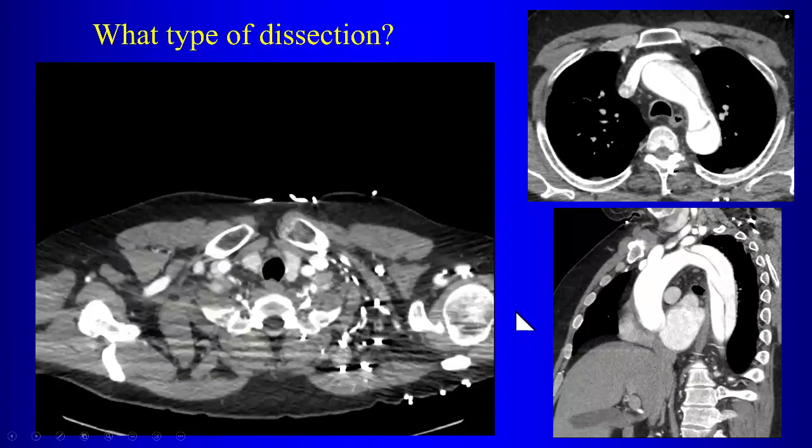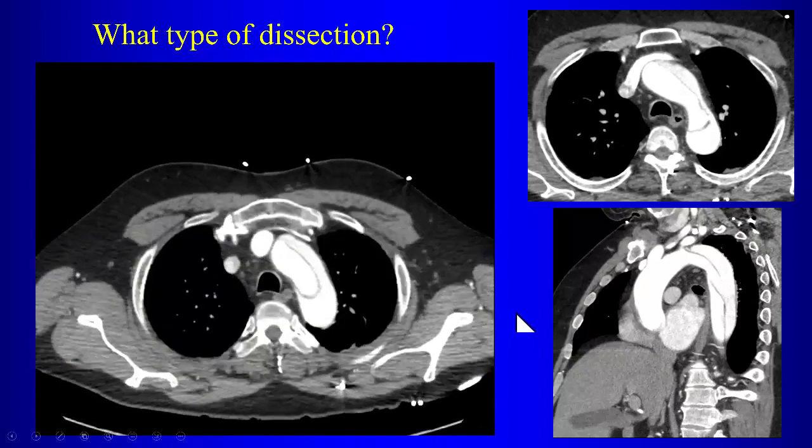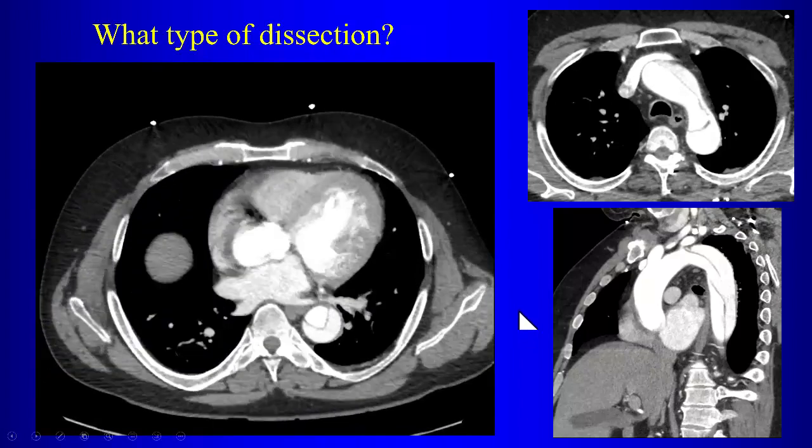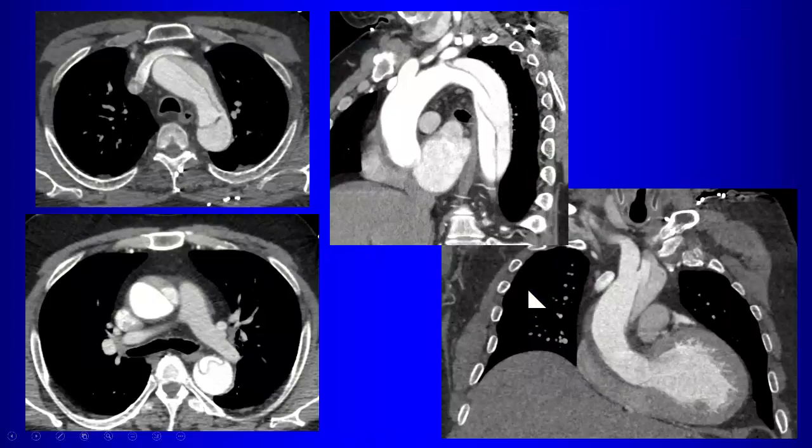So, surgery. All right, so you're saying the patient should go to open surgery and have a graft placed in the ascending aorta? Okay. Well, that has recently been changed in terms of how we approach these kinds of cases. So the tear is in the descending aorta and it propagates into the ascending aorta, okay?